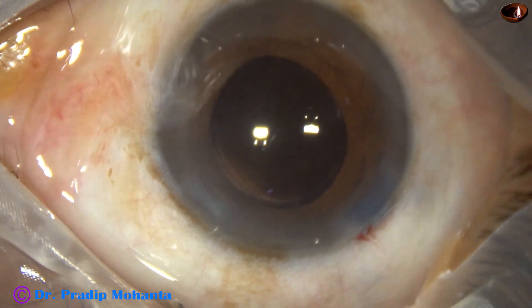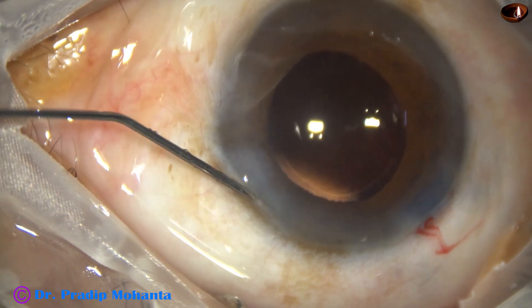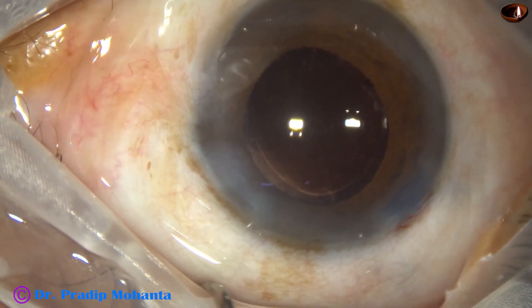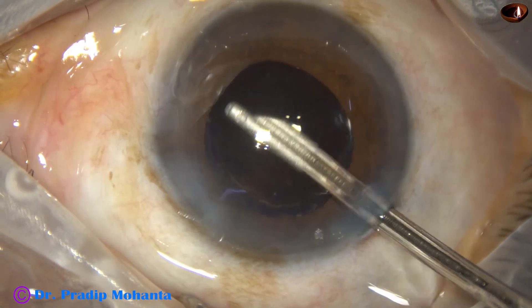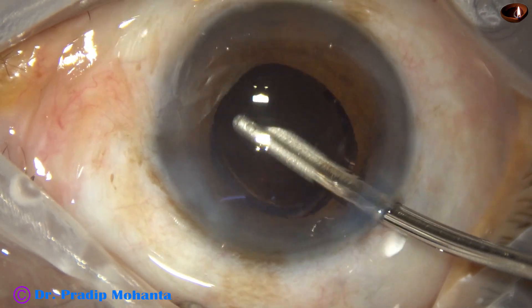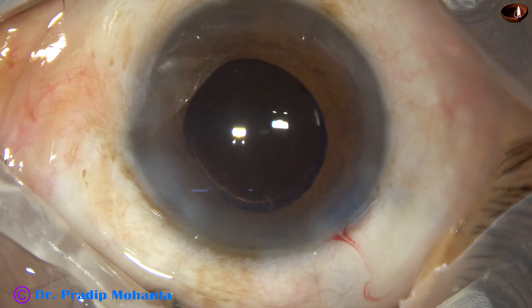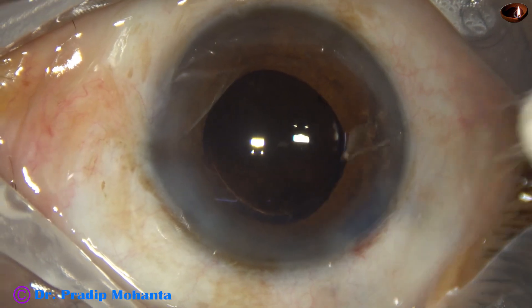This is a bit of moxifloxacin and I am using BSS to hydrate the corneal stroma to close the side port. This is the final lavage of the anterior chamber with the 23G Simcoe. All the viscoelastic is removed, the anterior chamber is nicely formed, and integrity of all the wounds is checked with the cotton-tipped Johnson bud.